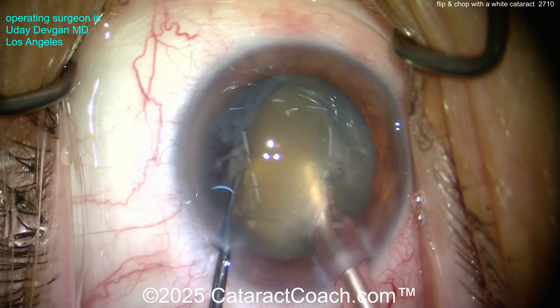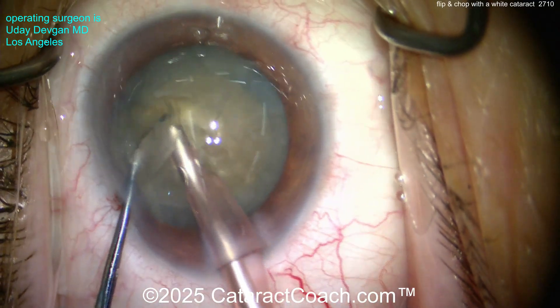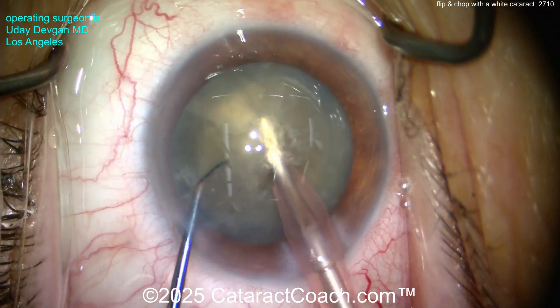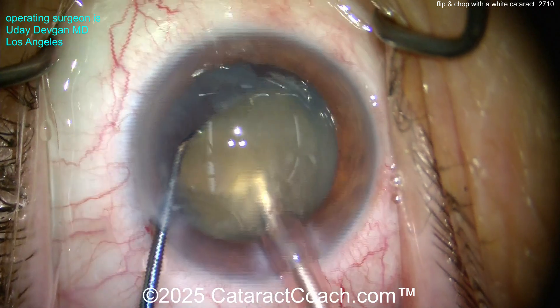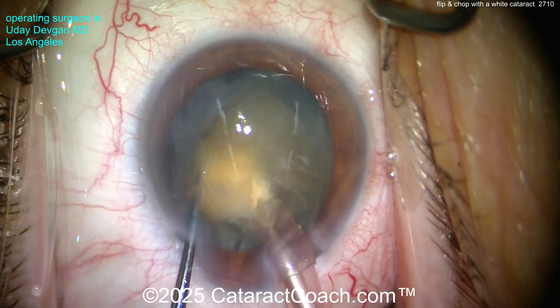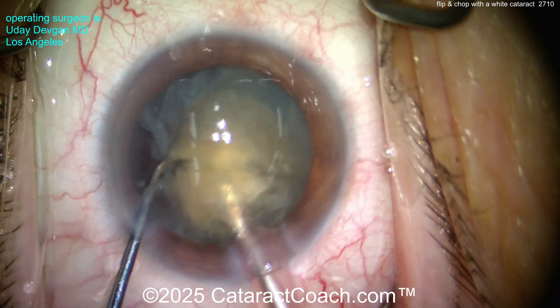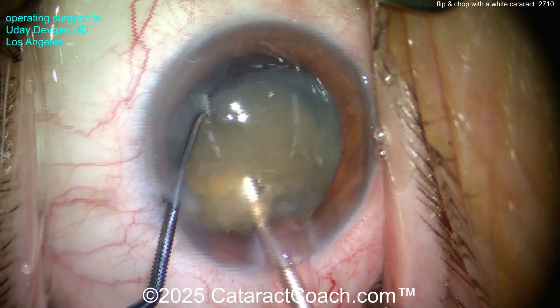Look at the chopper — placing it behind the posterior plate of the nucleus and then we try to split it. Pretty dense cataract; it didn't even split fully the first time. Let's try again — buzz in again to the nucleus, get a good grip, chopper around it, and the chopper goes to the back posterior plate of the nucleus. Position it appropriately — there we go. Be careful of the capsule, and now look at this chop. Oh, that's a good chop!